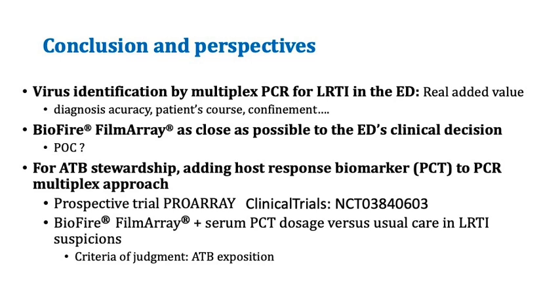For antibiotic stewardship, we think it could be really interesting to couple the PCR identification of the virus and a host response biomarker like PCT. And this is the target of the prospective trial ProArray, which we will conduct in a few months.